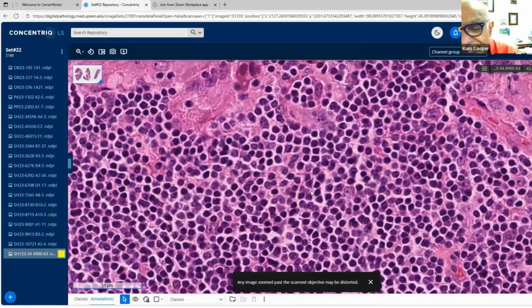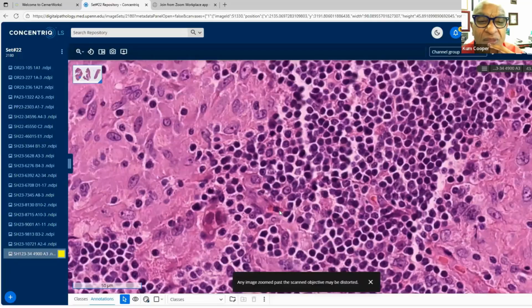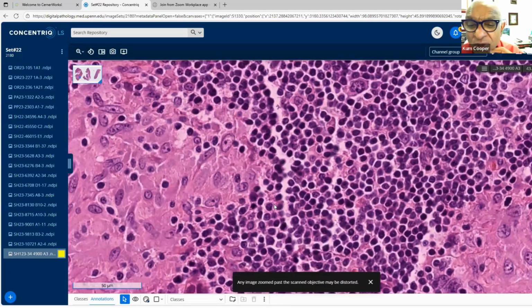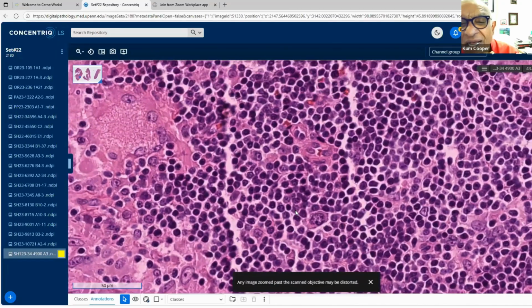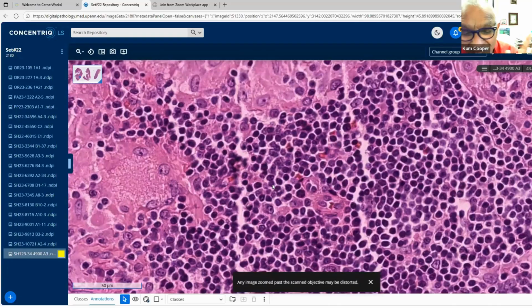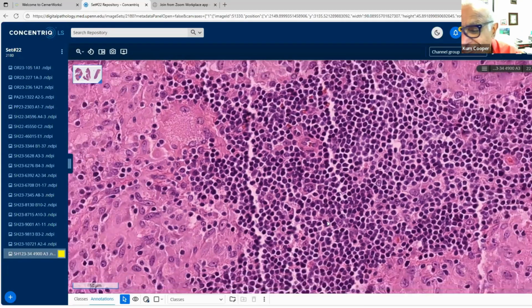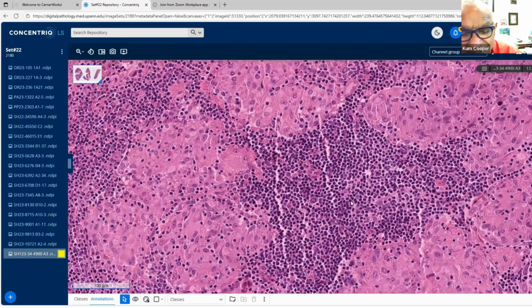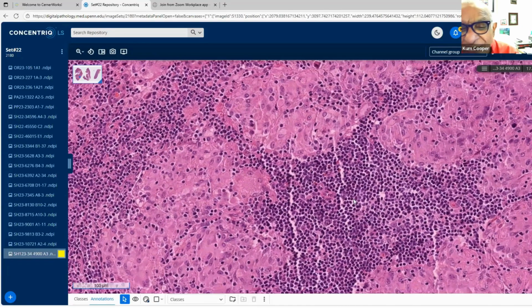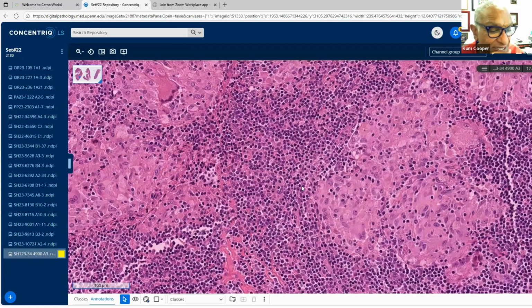And my good friend Adam Bagg did a host of immunohistochemistry on this. Okay, which is where the intrigue comes in, because this is a fascinating case. And here's another one here as well. You can see these large cells. Prominent nucleoli, distinct. I can see Hodgkin's lymphoma, yes.